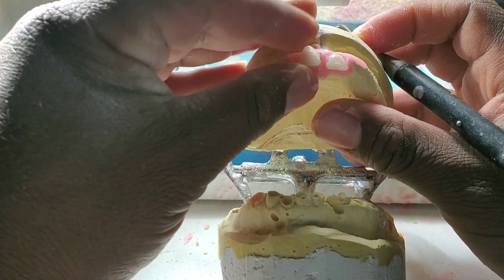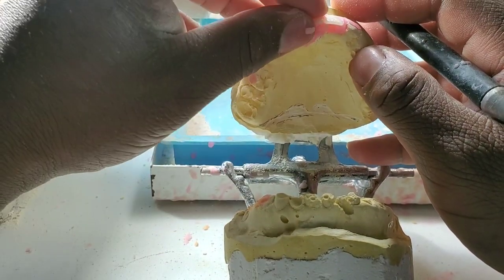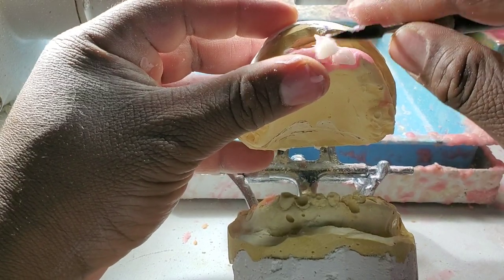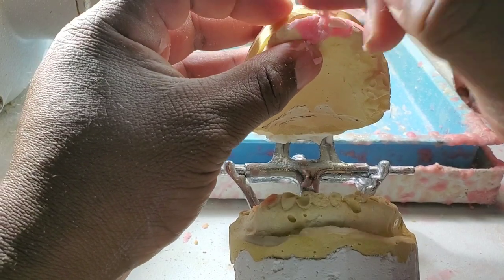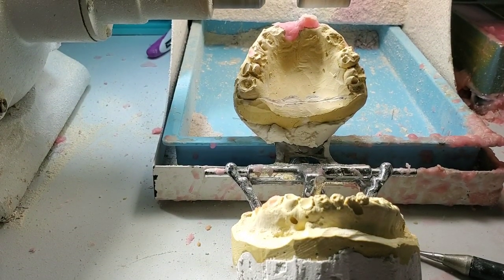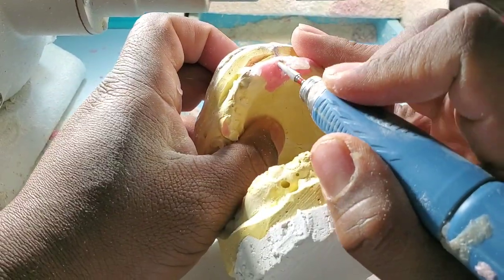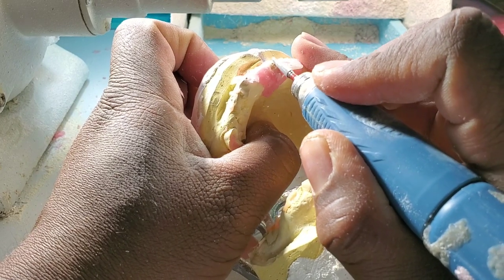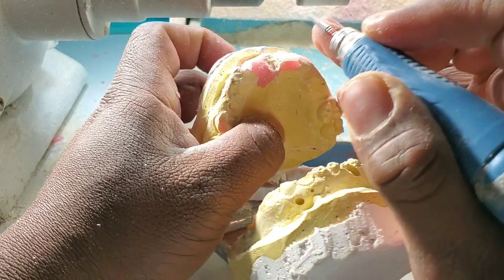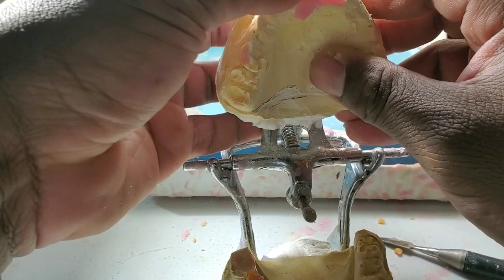I'm trying to place this central next to my other tooth. It doesn't want to stay because there is a big chunk of stone in that area right here, which I'm going to remove because my teeth need to be on the side of the other. It was a big chunk of a tooth but it was there. I removed it so my tooth can go back in there next to the other.